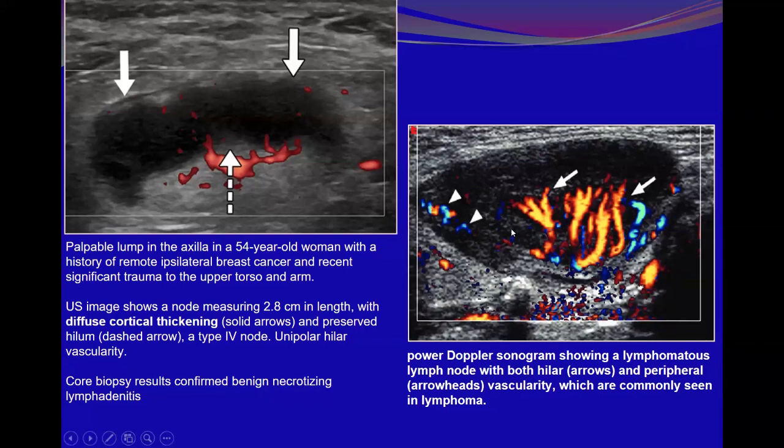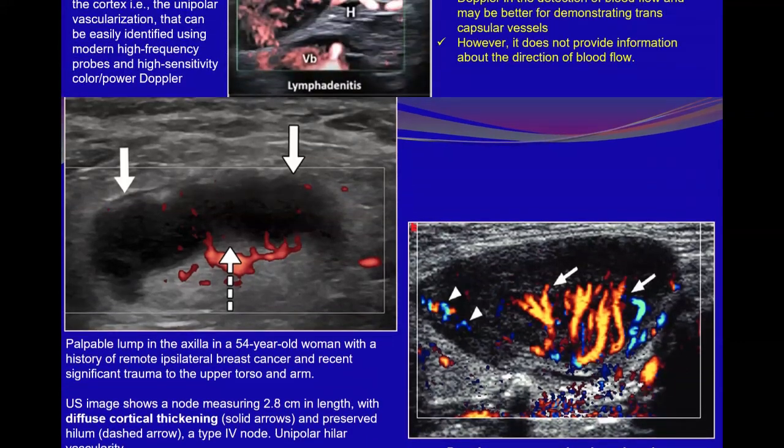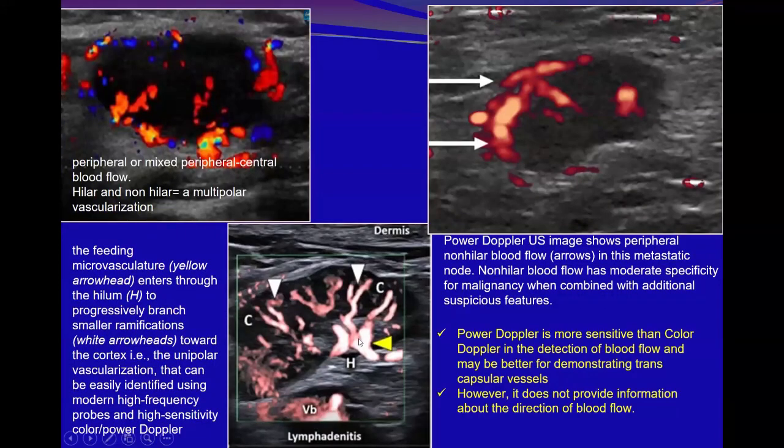No, we have the new vascularity peripheral here. Yes, but inside the lesion, it is so regular coming from the hilum. But if you look outside the lesion, you can see peripheral vascularity. Boss, one more comment. Even at the hilum, let me show you. Here, I can see the main vessel, and these are the branches.